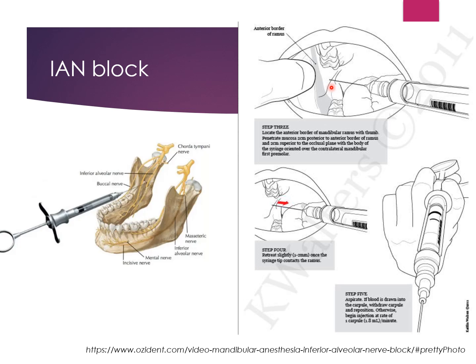Looking at it again, after bony contact is made, like that, the direction of the needle is changed and it is positioned toward the lingula and injected. There are many cases where the IAN block fails because the needle goes in another direction when moving backward and forward by changing the direction of the needle after bony contact.